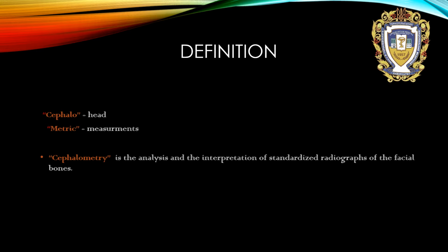Firstly, let's talk about definition. What does the word cephalometric mean? The word cephalometric consists of two parts: cephalo, which means head, and metric, or measurements. So cephalometry is the analysis and the interpretation of standardized radiographs of the facial bones.